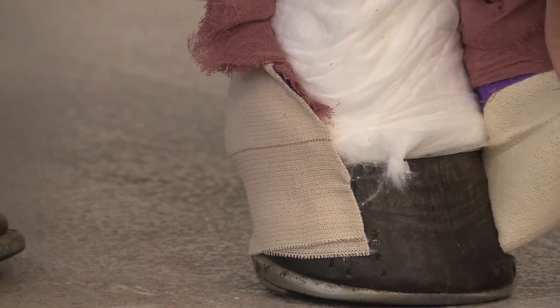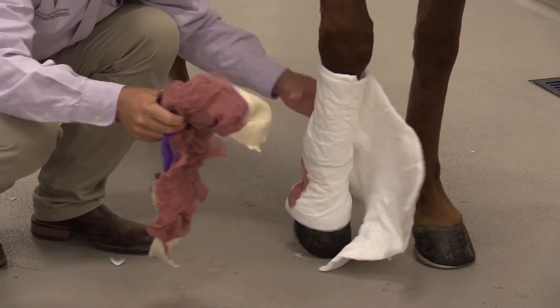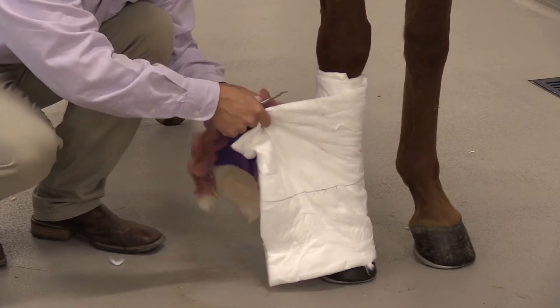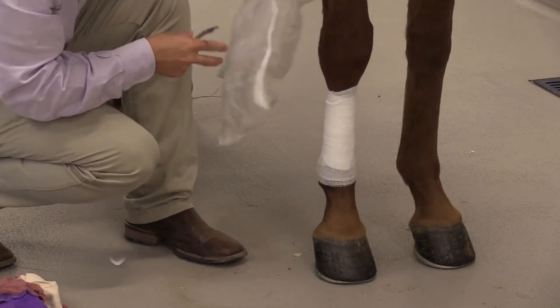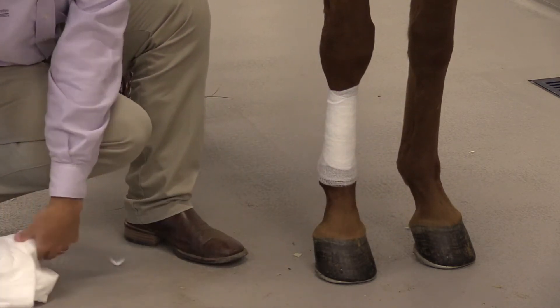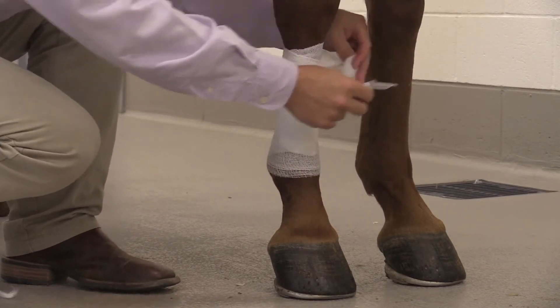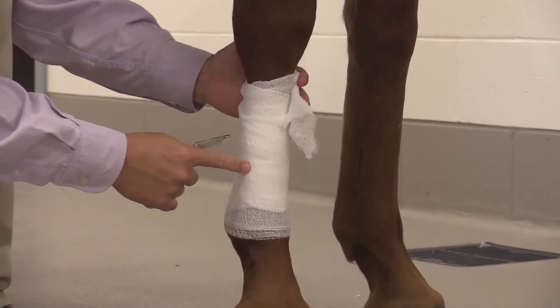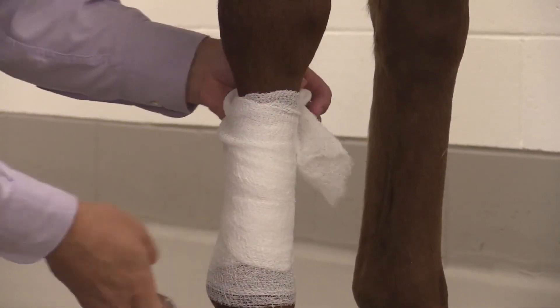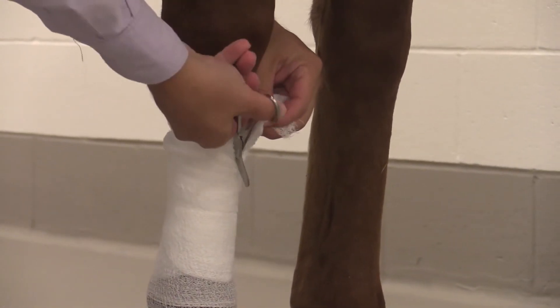Now that we've got the outer layer off, we will just unravel the leg cotton. Most of the time the leg cotton, especially if there's a wound underneath, will also be dirty with organic debris — whether blood, serum, or dirt. So reapplying it may not be beneficial; you may need to use a new leg cotton or combi roll. Now getting ready to remove where there was a wound, you can cut it off with bandage scissors away from wherever the wound is, as the blunted protective tip is less likely to cut the skin while removing the bandage.